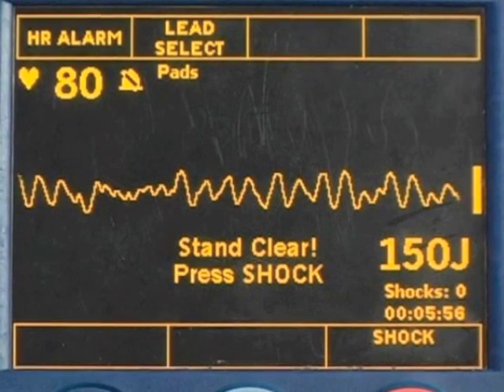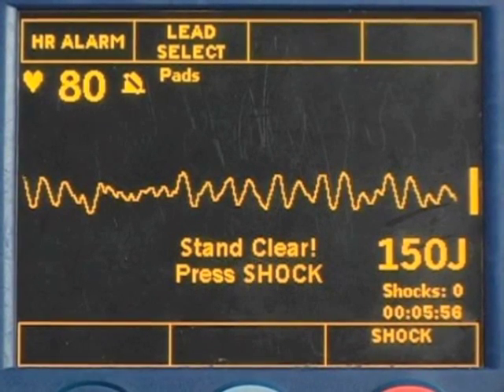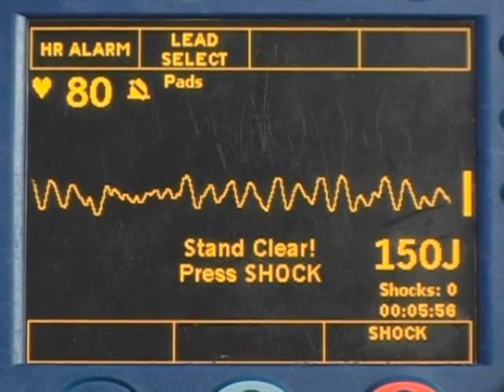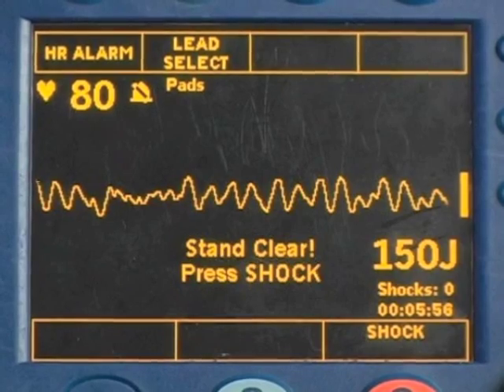Shock advised. Stand clear. Press shock. Shock delivered.